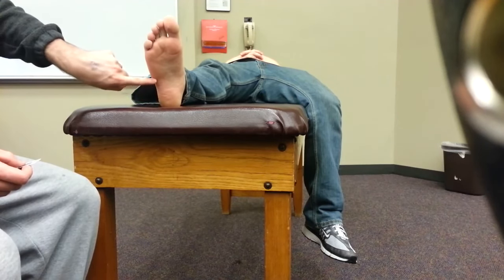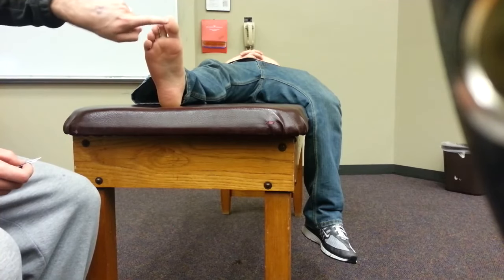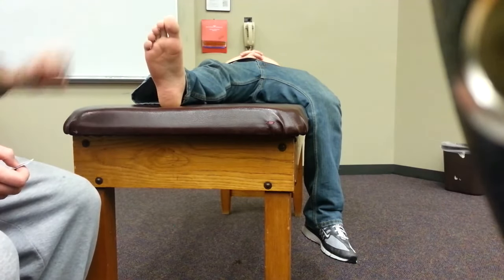Locations are going to be here, here, here, here, here, here — then one on three toes, and also one on the dorsum of the foot.